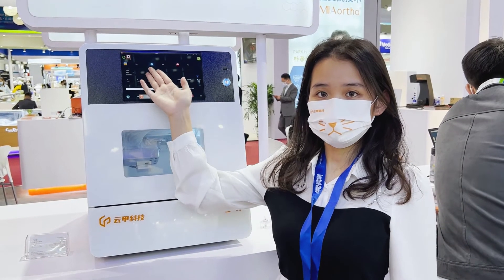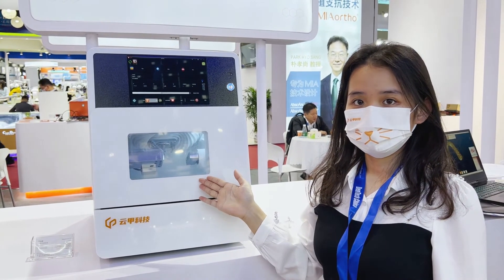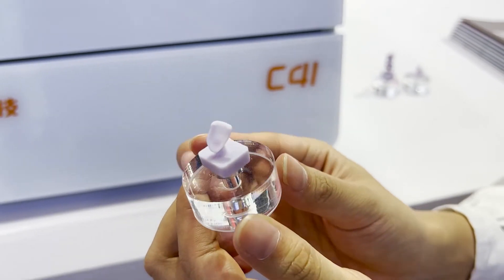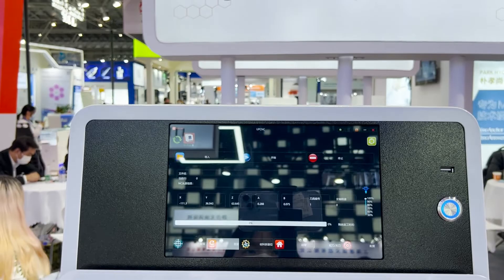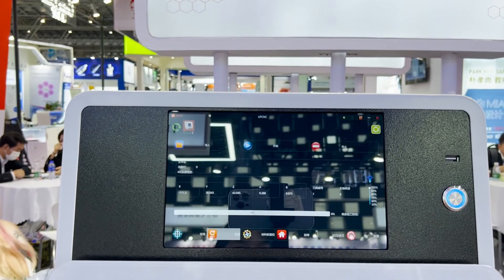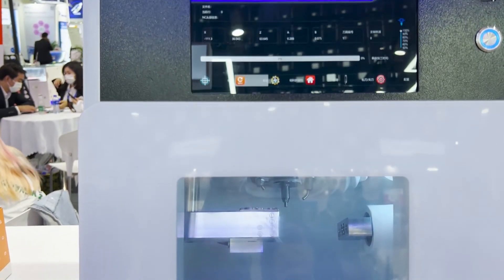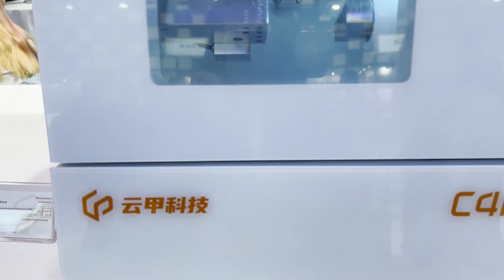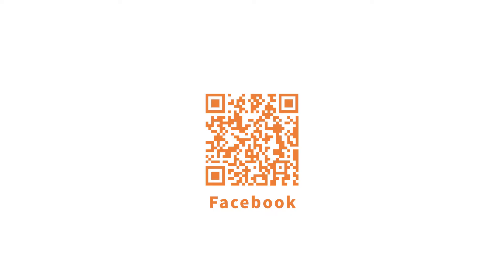Now we will see the chair-side solution P41, a wet dental grinding machine. It is made for grinding glass ceramics for veneer, crown, inlay and so on. P41 has a built-in computer, very easy to operate, space saving to put in the dental clinic, and realizes immediate restorations for patients.